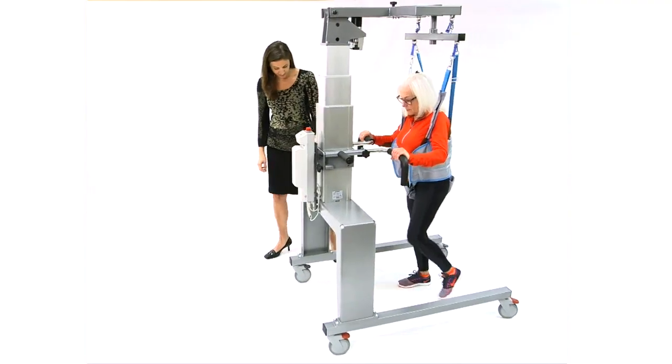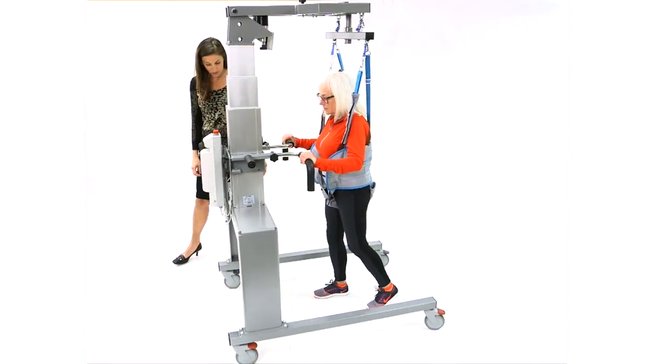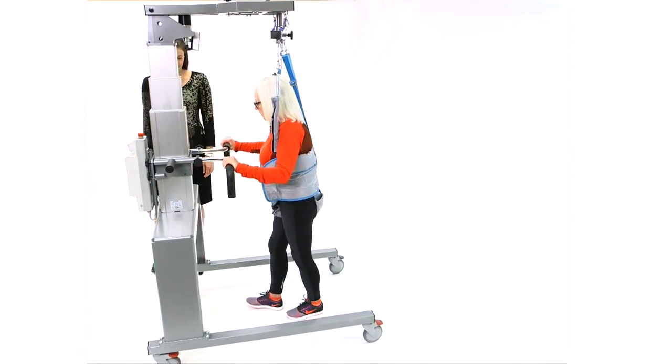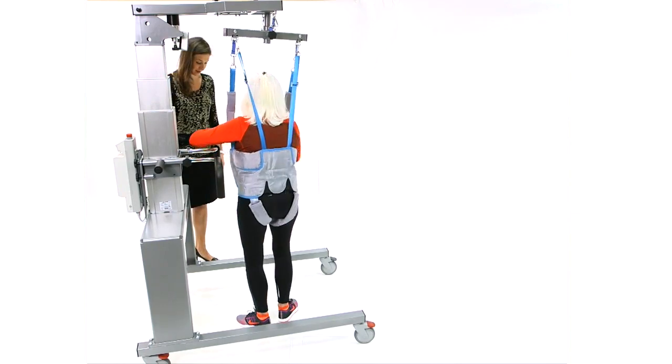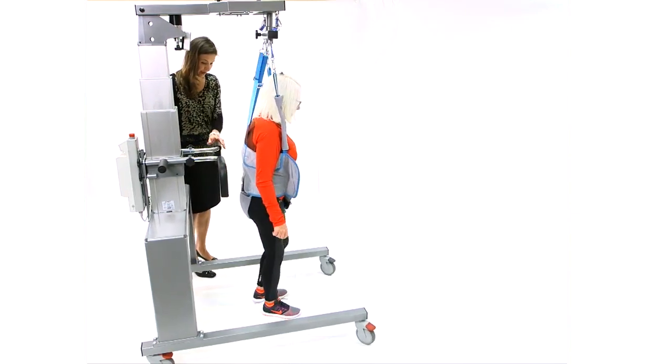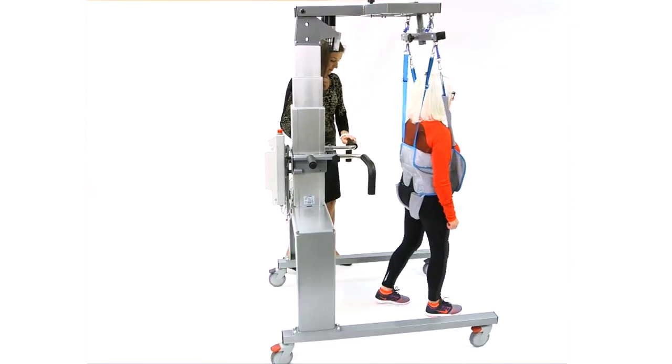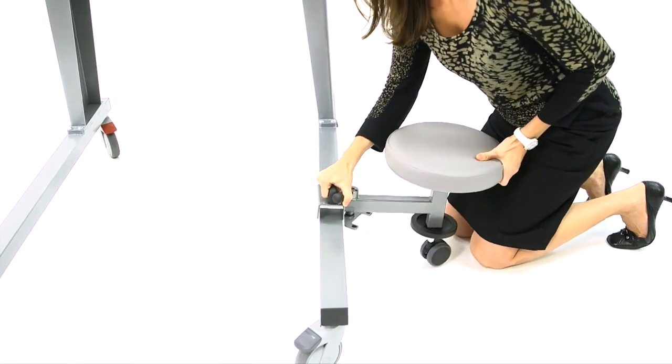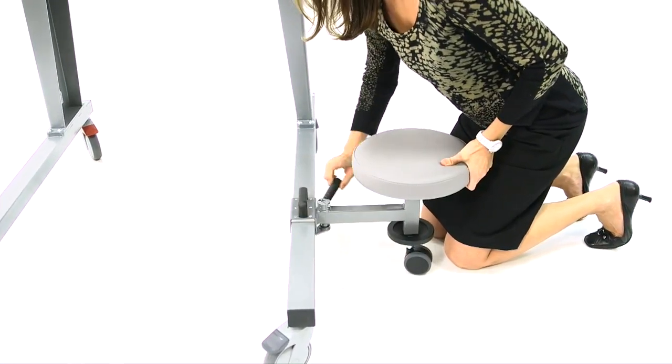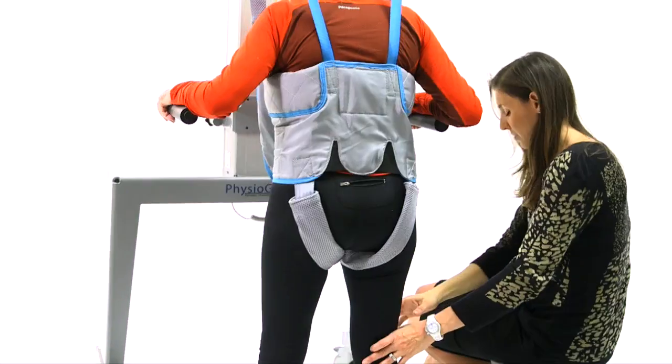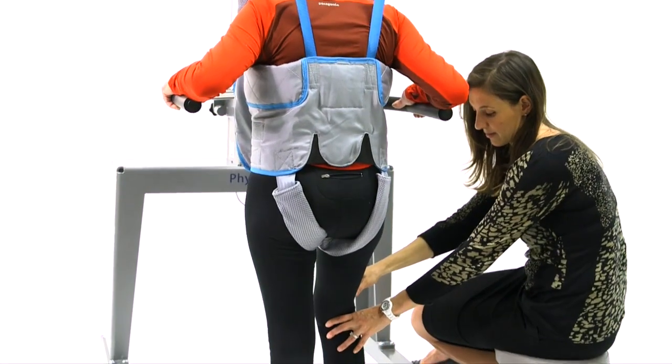By using the rotating 360-degree yoke plus, patients can move freely during over-ground therapy without repositioning the device. The Open Design and Magnetic Physiostool provide the clinician with unobstructed access to assist patients in initiating and performing proper gait mechanics.